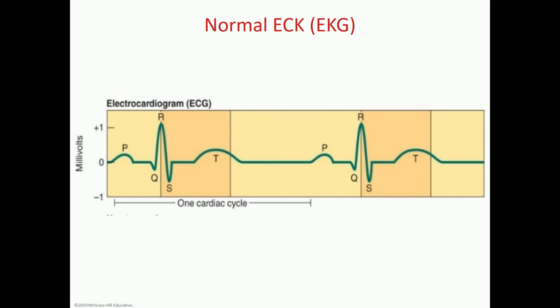Now the PQ interval, this interval, sometimes, if you cannot see this Q part, we use what is known as the PR interval. That corresponds to the time where the action potential goes from the SA node down to the AV node.